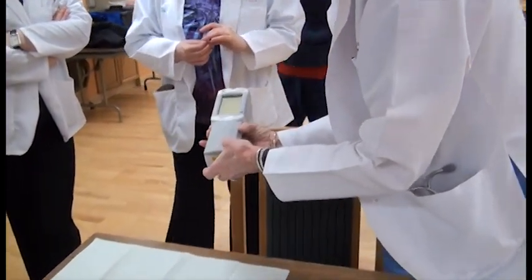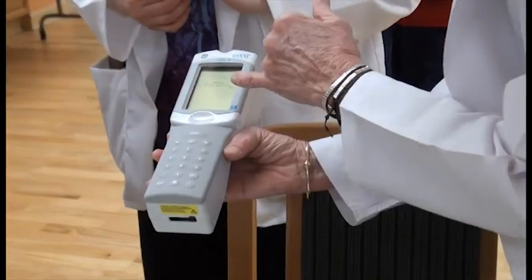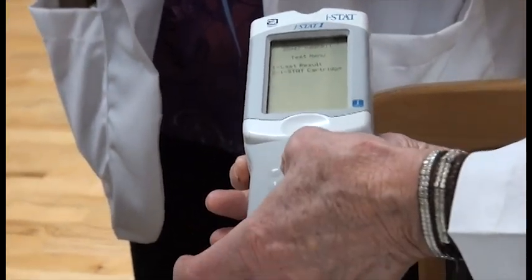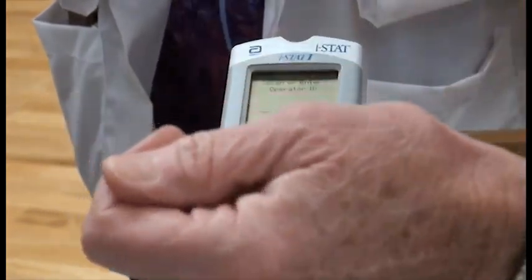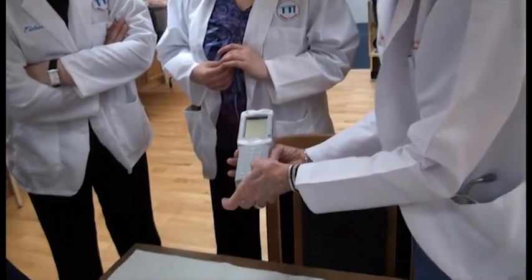To turn the meter on, you simply hit the on-off switch. The first thing you're going to see is number one: last result, and number two: iStat cartridge. We're going to do number two, iStat cartridge. Now it tells you to scan or enter the operator ID. You don't have an operator ID, so you're just going to hit enter.